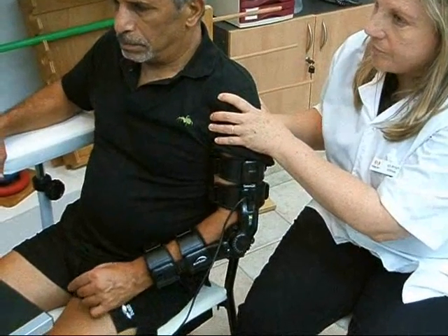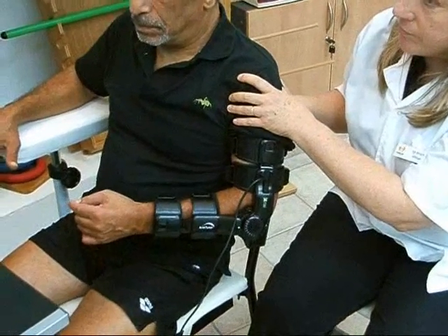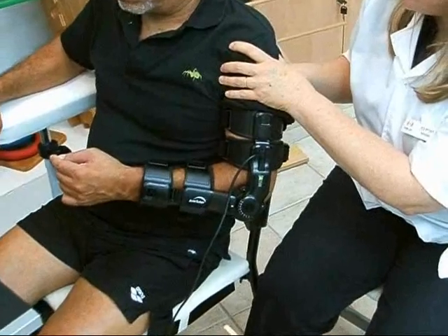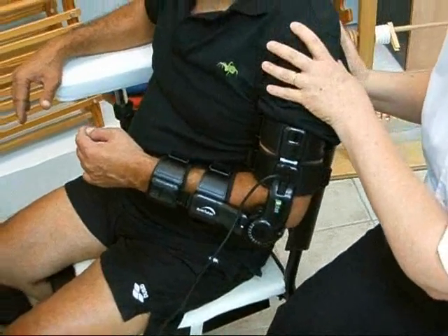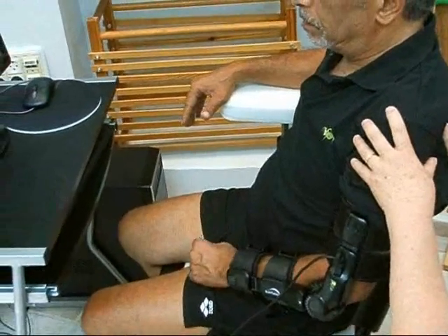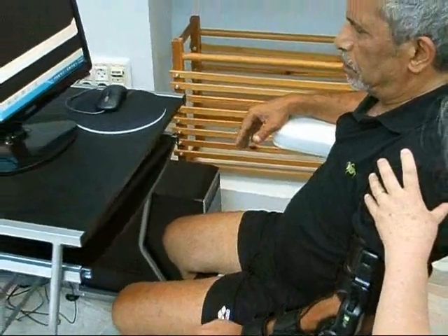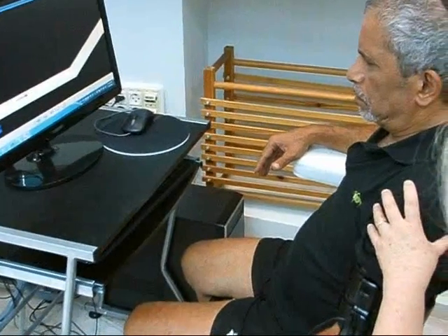The games are customized to the patient's motor, sensory, and cognitive movement ability. The exercises can be undertaken in different positions including sitting, standing, or lying, with the patient performing assisted active, active, or against-resistance exercise practice.